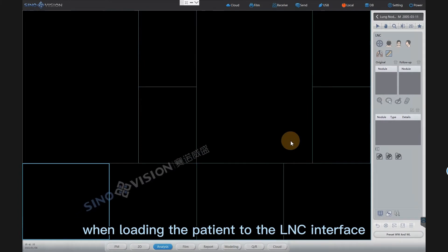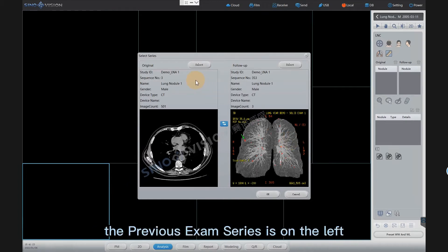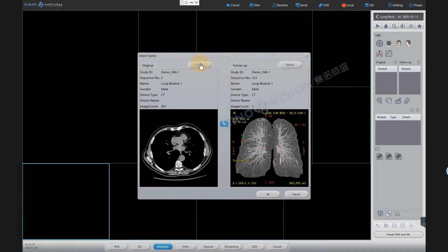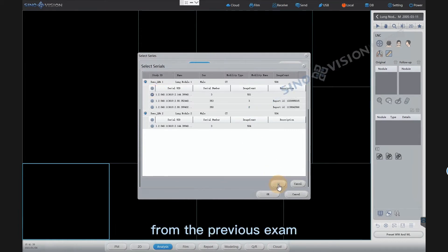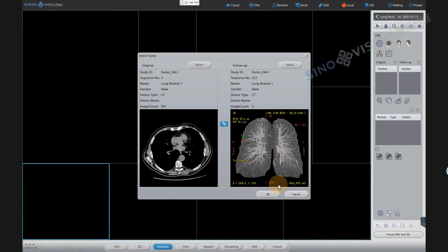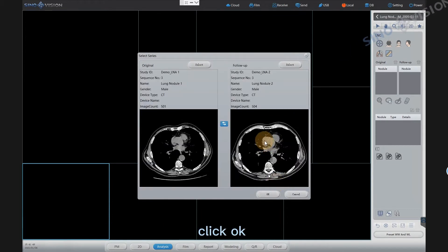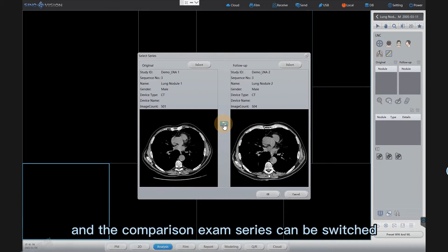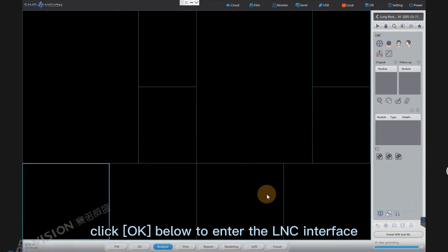When loading the patient to the LNC interface, the series selection dialog box will pop up. The previous exam series is on the left, and the comparison exam (follow-up exam) series is on the right for selection. Click the select button on the left and select the soft tissue thin layer image series from the previous exam, then click OK. Then select the soft tissue thin layer image series from the comparison exam and click OK. Through the switch button in the middle, the previous exam series and the comparison exam series can be switched. After series selection is completed, click OK below to enter the LNC interface.